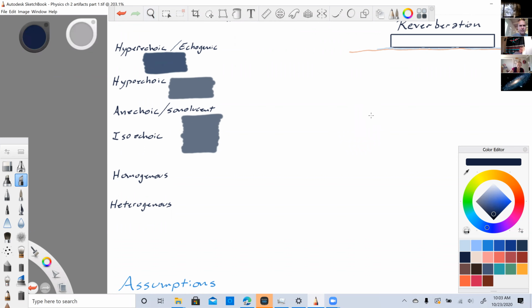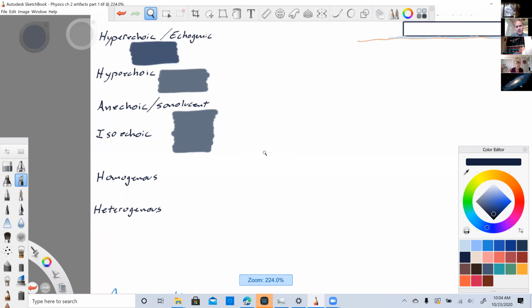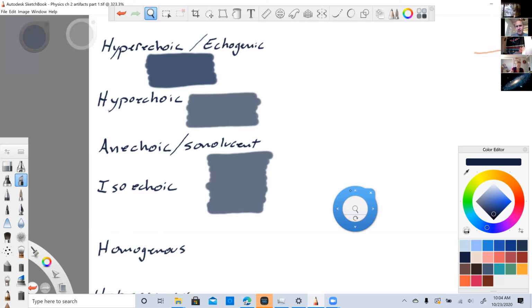or echogenic. Well, that doesn't look hyperechoic or echogenic. So these splotches of color represent just tissue. Whatever tissue, does not matter. It's just a graphical representation of tissue. So if I wanted to see something hyperechoic in that tissue, well, that's very hyperechoic. Can't get any whiter than white, or brighter than bright white. So it is hyperechoic. It's also echogenic, another term that they didn't use right here on page 356, but it's a common term, so we should use it.